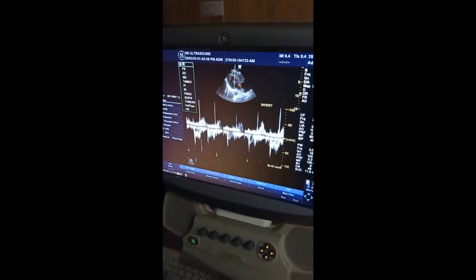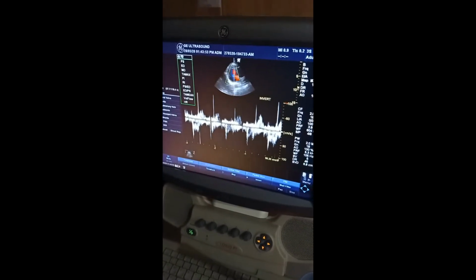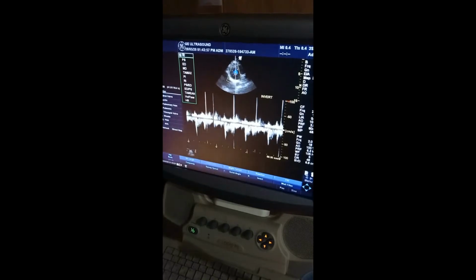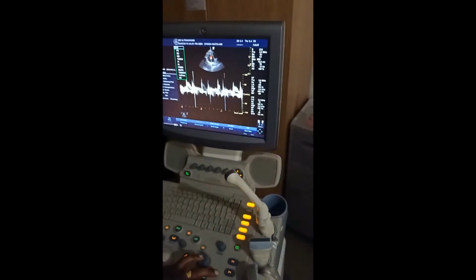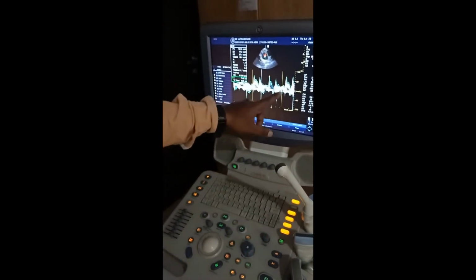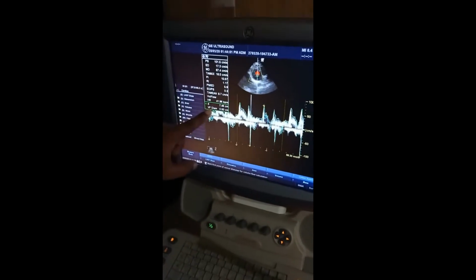and this is the scan area where you have to check. You can go through. Okay. Automatically the calculations will come according to the preset settings. You can see the calculations here.